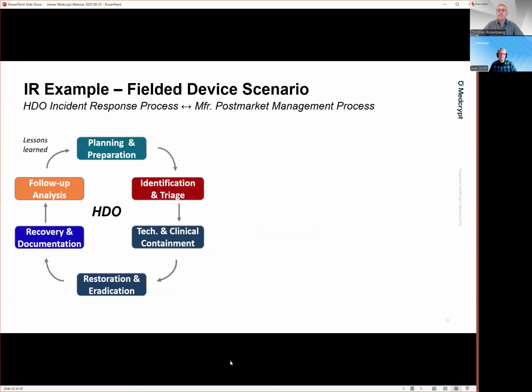But back to the customer-based products, right? Products operated by a healthcare delivery organization, by a hospital. We talked about this circle earlier, but we also talked about the medical device manufacturers' post-market surveillance activities, right? And one of the inputs into post-market surveillance should be information about security events and incidents at customer side, and they may be detected directly by the device and reported back, or they may be provided to you by your customers, where they pick up the phone and ask for support in a security incident.